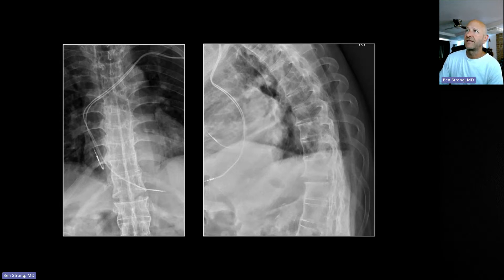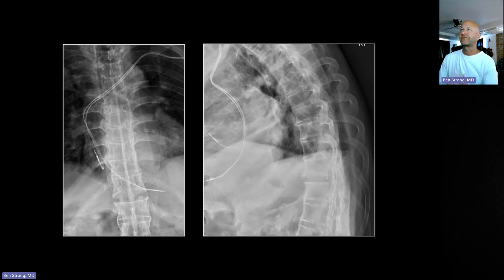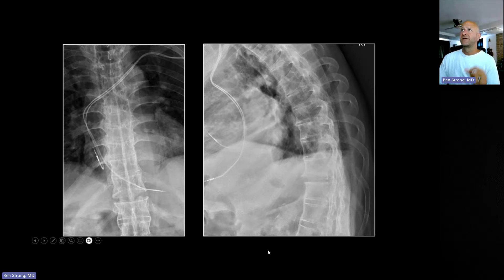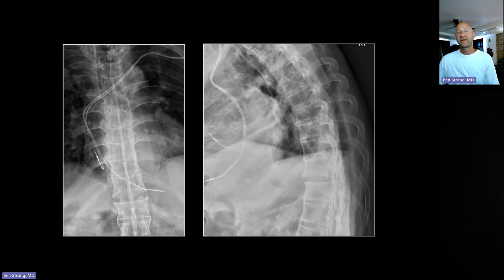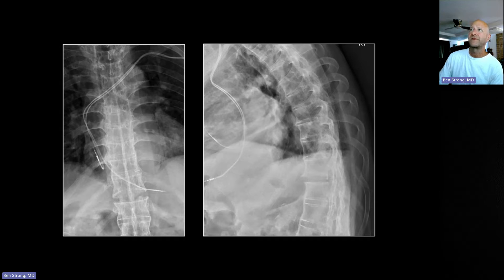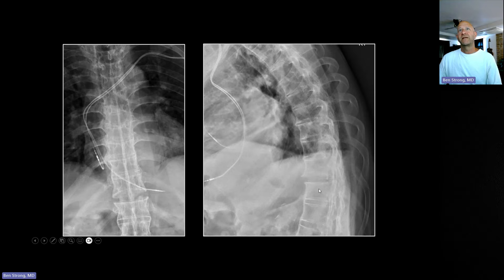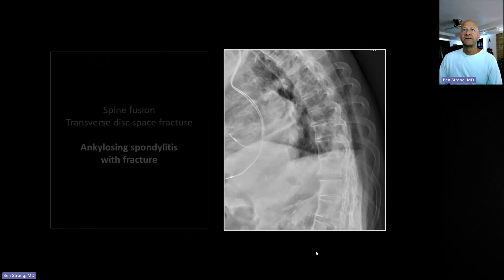If you see a fracture in an ankylosing spondylitis spine, recommend that the entire spine be imaged. They typically don't break in just one place when the entire spine is fused, because of that fusion and inflexibility. If you're wondering about your diagnosis of ankylosing spondylitis, make sure you get a view of the sacroiliac joints and confirm they are fused. If the sacroiliac joints are not fused, whatever you're looking at in the spine is probably not ankylosing spondylitis — that is a pretty solid pearl. Image the whole spine when you see a fracture in AS.